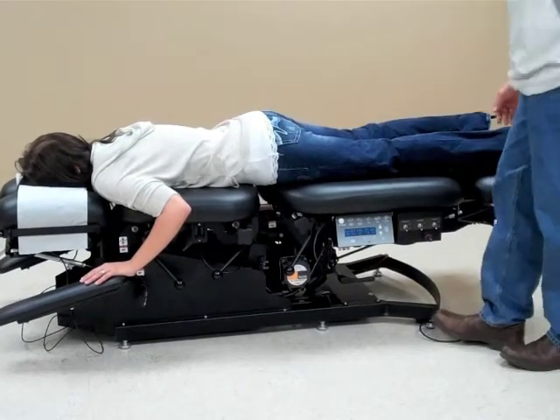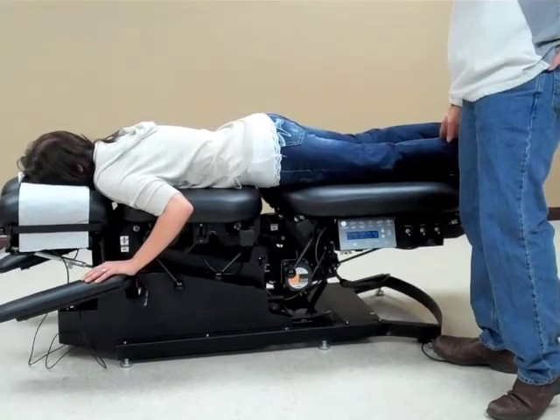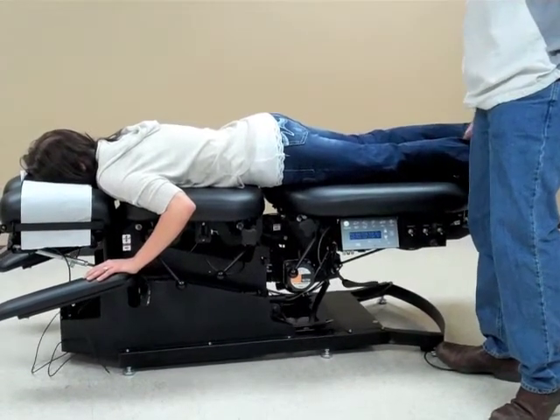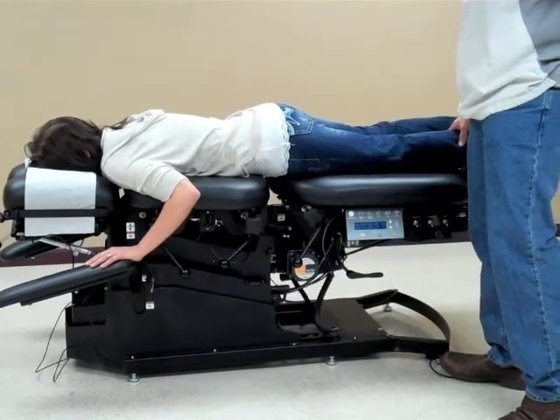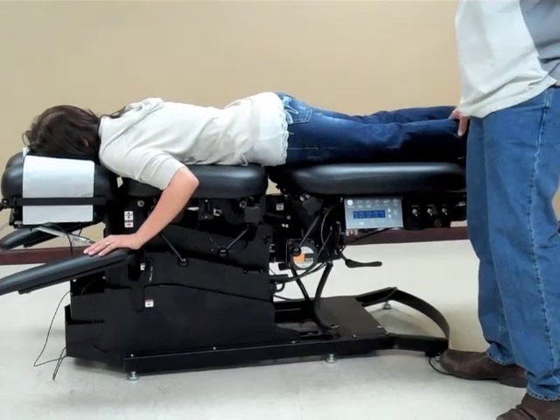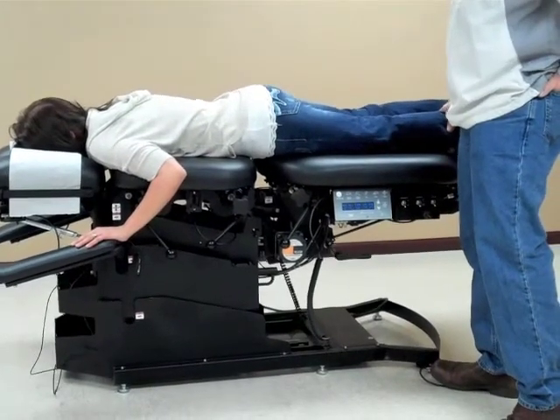Once we have the patient on the table, we're going to elevate the table to a higher level — easier to put the ankle straps on and to maneuver the patient. So right now I'm going to elevate the table up to the highest level where it's easier for me to work on.